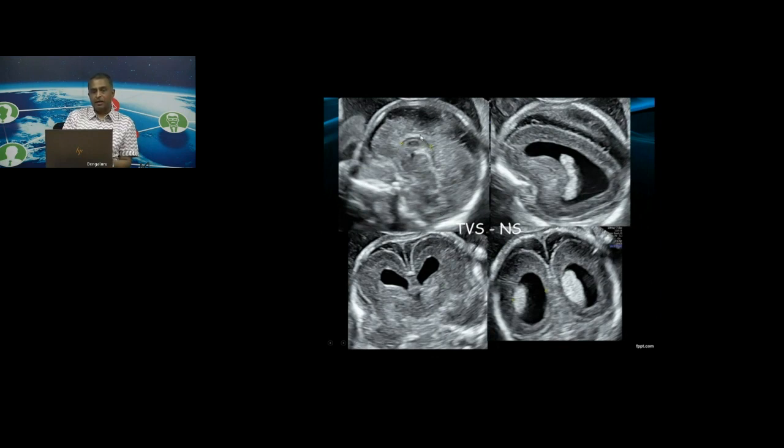That's the midline, mid-sagittal structure. You see the vermis is there, the corpus callosum is present. You see the ventricle on one side, parasagittal. You see the coronals in the transcaudate plane and also in the transcerebellar plane. You don't expect sulcation at 19 weeks, so I'm not going to say a word about whether this is going to be normal sulcation-wise, but I know that there is no other problem except for a very small CSP and ventriculomegaly.